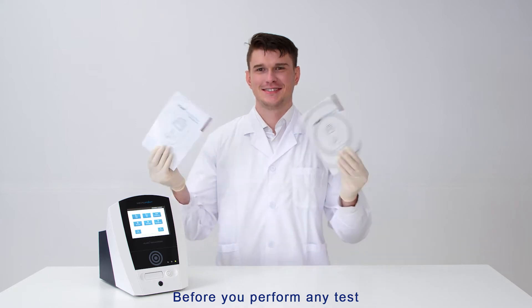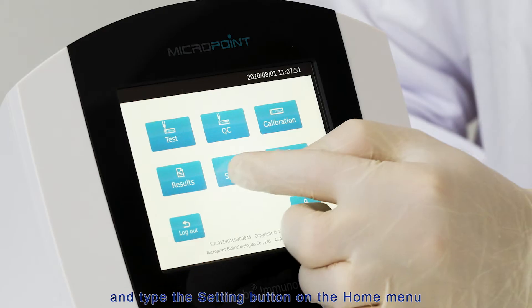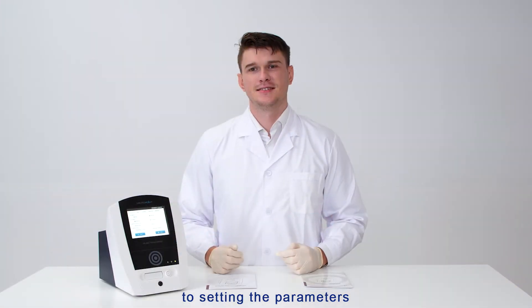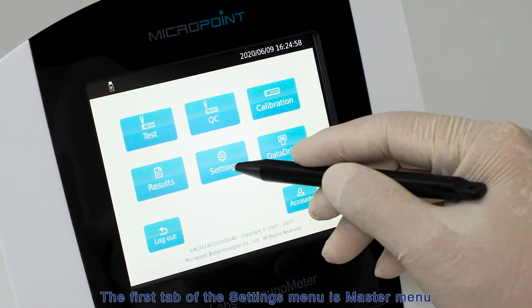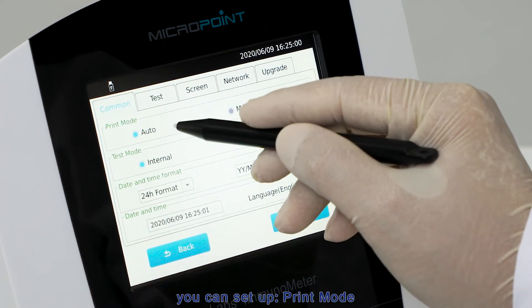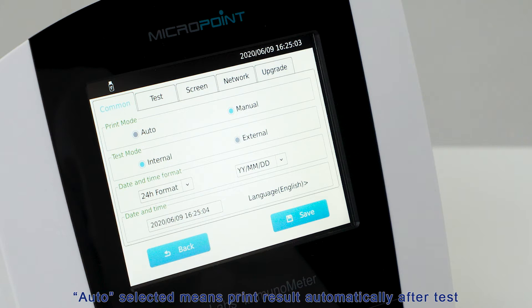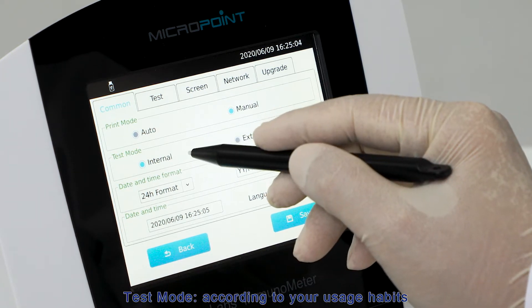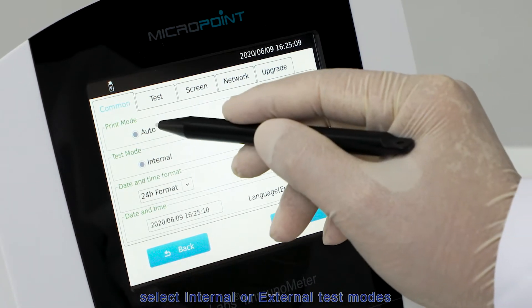Before you perform any test, please refer to the user manual for detailed instructions and tap the Settings button on the home menu to configure the parameters. The first tab of the settings menu is the master menu, where you can set up print mode: auto selected means print result automatically after test, and manual selected means print result manually. You can also set the test mode according to your usage habits — select internal or external test modes.